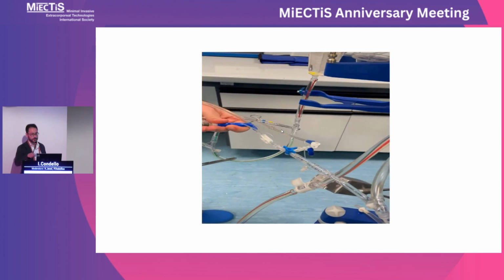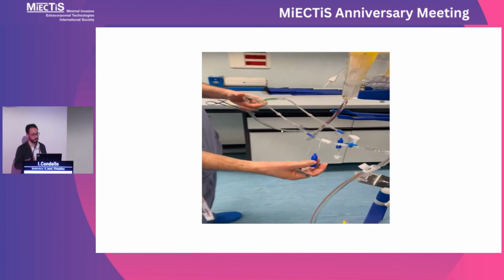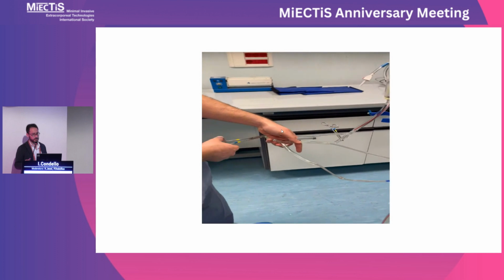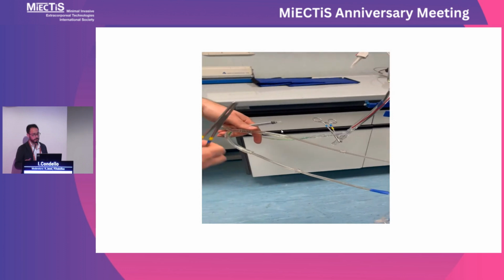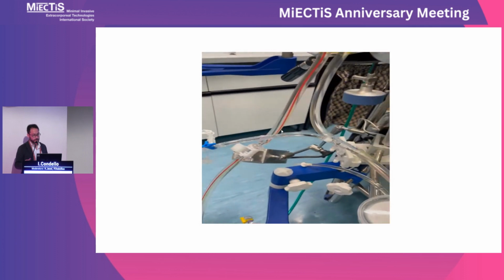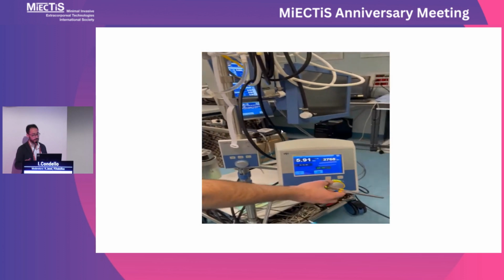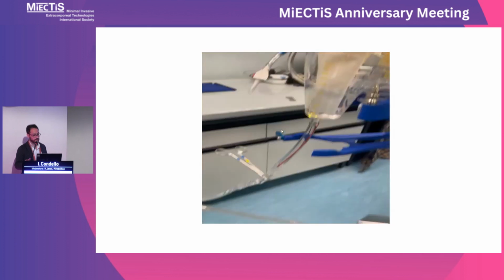We create a venous reservoir with liquids in continuity with our MiECC. We control the pressure, and we start with the aspirators of the liquids from the venous reservoir. In this context, it is a pulmonary venous return. We open the venting line in continuity with our bubble trap without extracavitary cardiotomy, increase the RPM, and we observe that there is a very beautiful, effective suction.